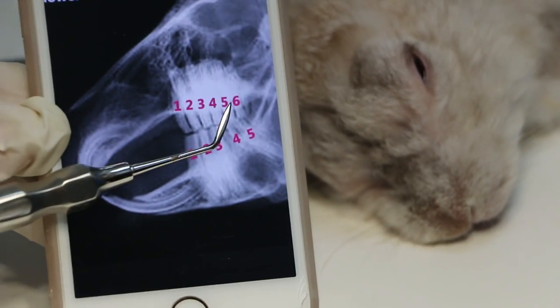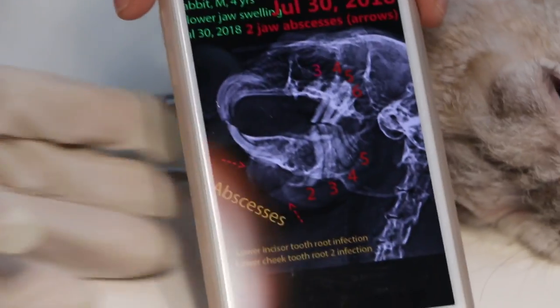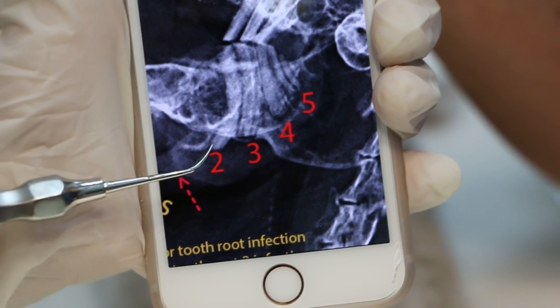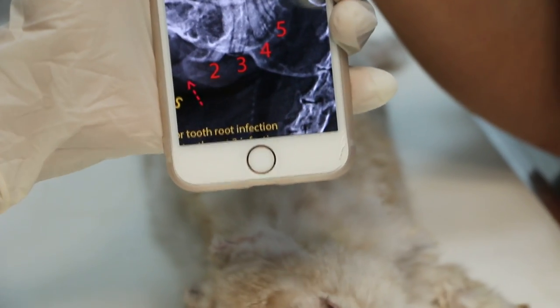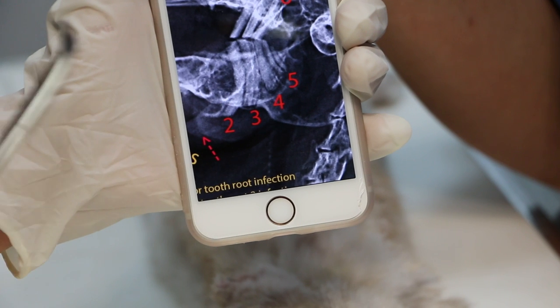This is a normal rabbit's teeth — they are healthy with no holes. Now we show an X-ray of a rabbit with a rotten tooth. The tooth is quite loose. The molar luxator goes in from below the root to loosen the ligament. Since this is a rotten tooth the ligament is already quite loose. The extractor then goes in to pull the tooth out — either from below or upwards.